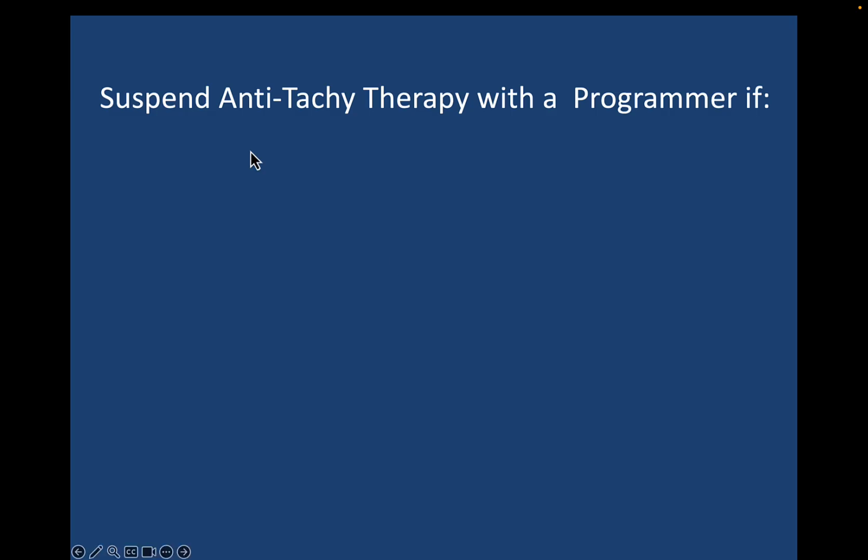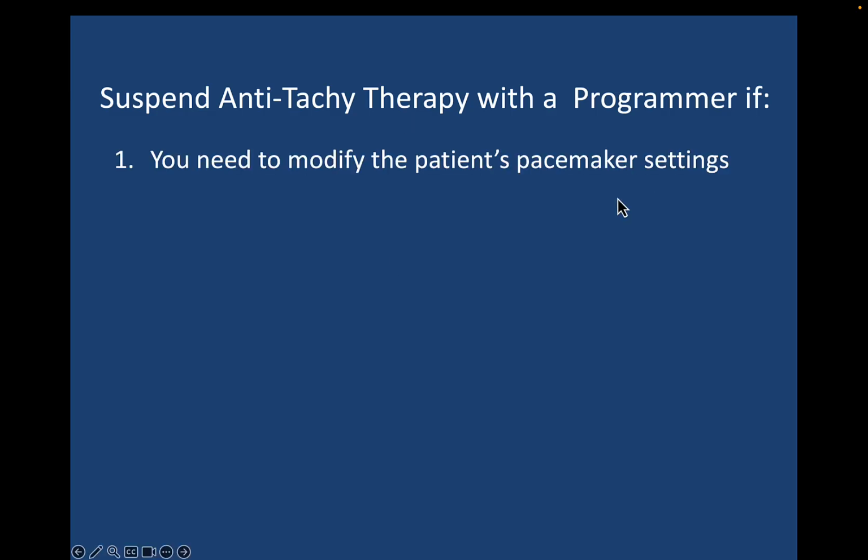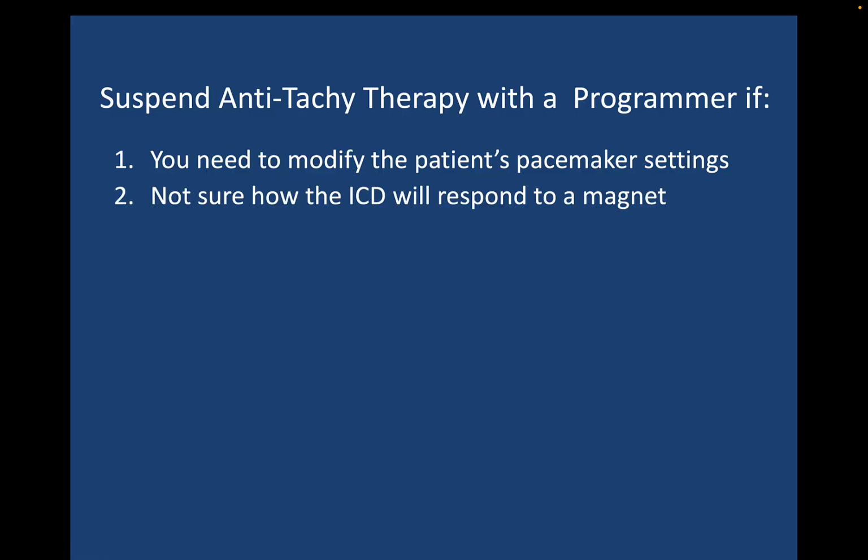I would suggest that you use a programmer to suspend the anti-tachytherapy if you need to modify the patient's pacemaker settings. That's pretty straightforward, right? That you have to do that. If you're not sure how the ICD is going to respond to a magnet, I recommend a programmer. If gravity may displace that magnet, programmer.